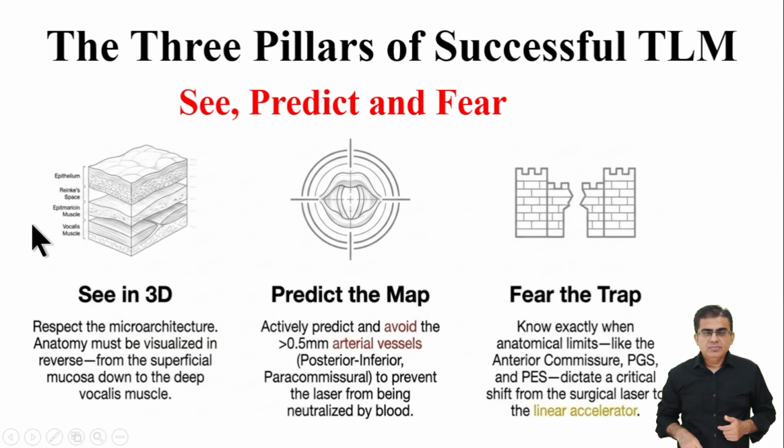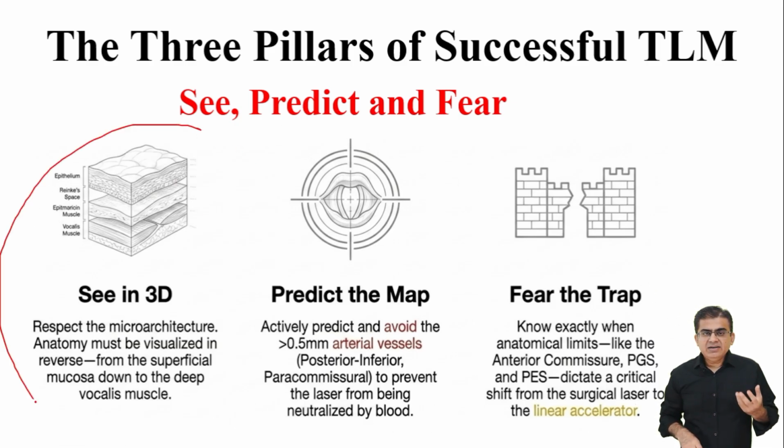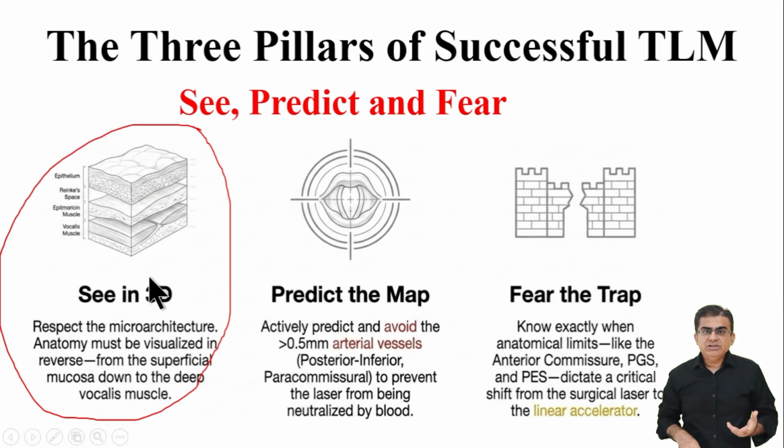First, you must see the anatomy in true 3 dimensions. You must train your brain to visualize the larynx in reverse. You must respect the microarchitecture from the superficial mucosa down to the deep vocalis muscle.